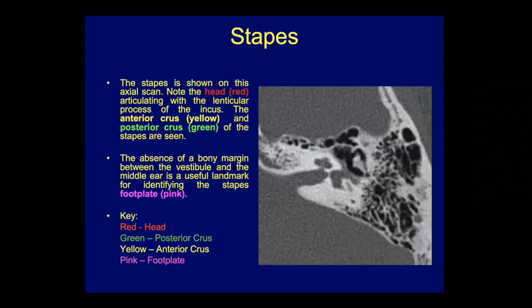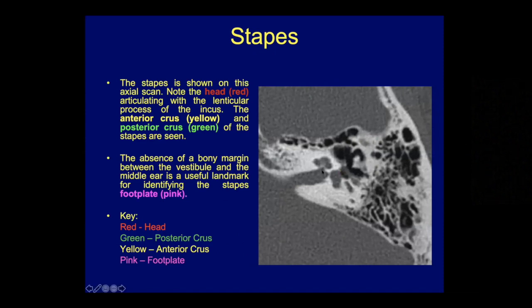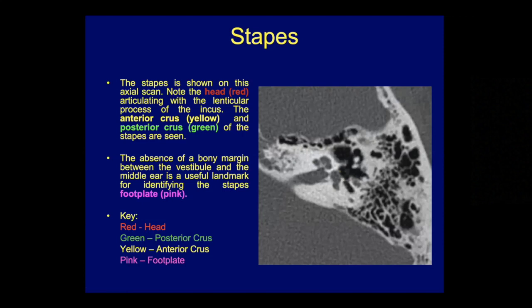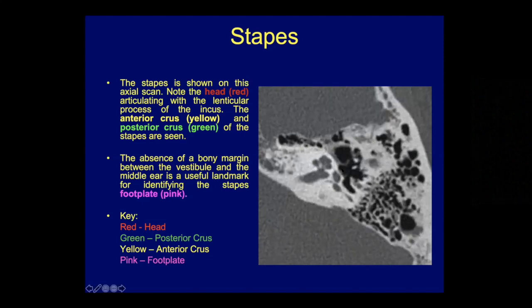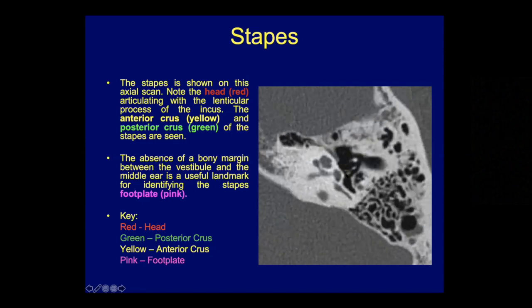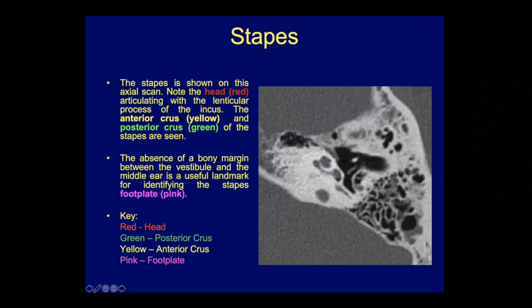Going through the anatomy of the stapes from top to bottom: starting a little lower since the stapes is lower on the medial wall of the middle ear. The cochlea, internal canal, and vestibule are visible, with the stapes footplate marked in pink, the anterior crus in yellow, and the posterior crus in green. The head of the stapes is marked in red. Coming through the slices, the footplate is clearly marked with the base of the anterior and posterior crura. As we come down the two crura converge, and the head of the stapes appears in red where it contacts the lenticular process of the incus.